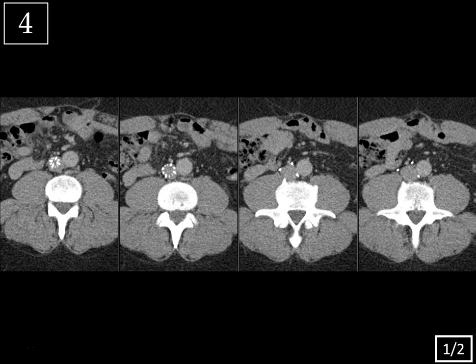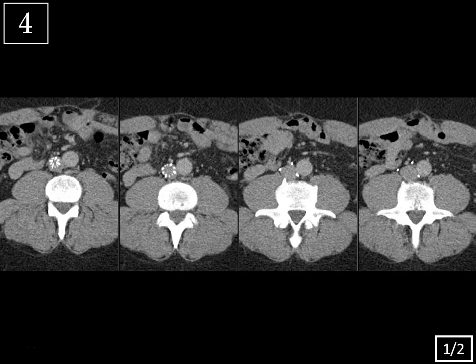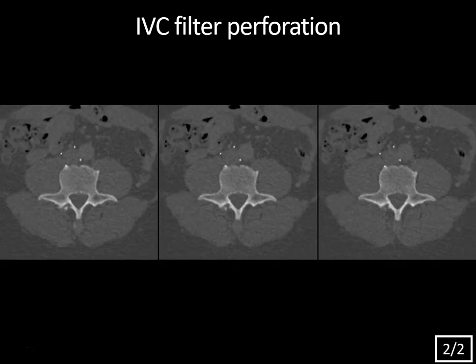Case 4, these are images of the mid-abdomen with contrast CT, slide 2 of 2 with bone windows. So we're looking at multiple images of an IVC filter, here it is right here in the IVC. As we move inferiorly, notice that the struts extend beyond the lumen of the IVC. Here you can see these two struts are surrounded by retroperitoneal fat — so this is an example of IVC filter perforation. And here on the bone windows, you can actually see that one of these struts, the posterior-most strut, is partially embedded in the cortex of the vertebral body here.